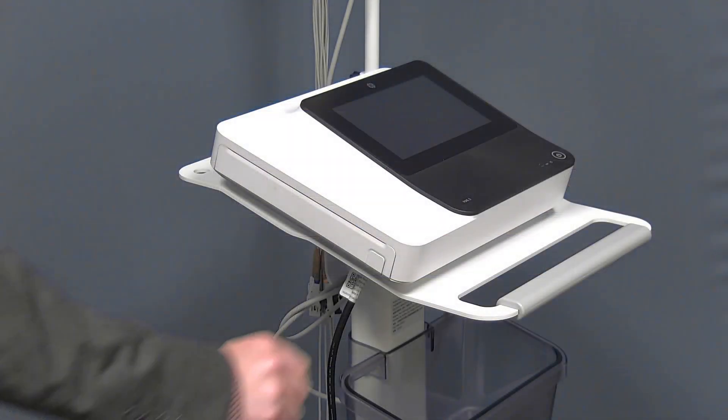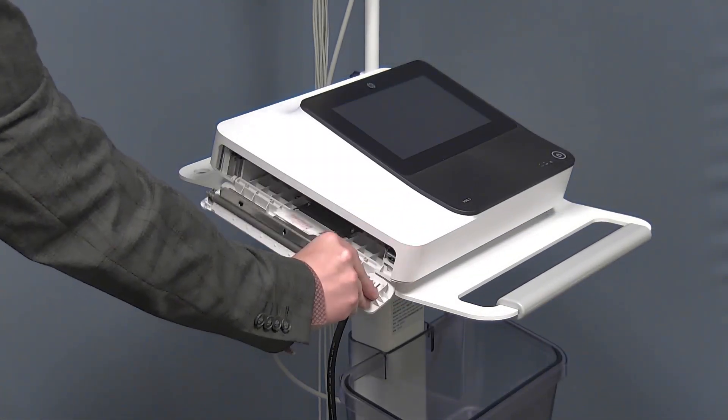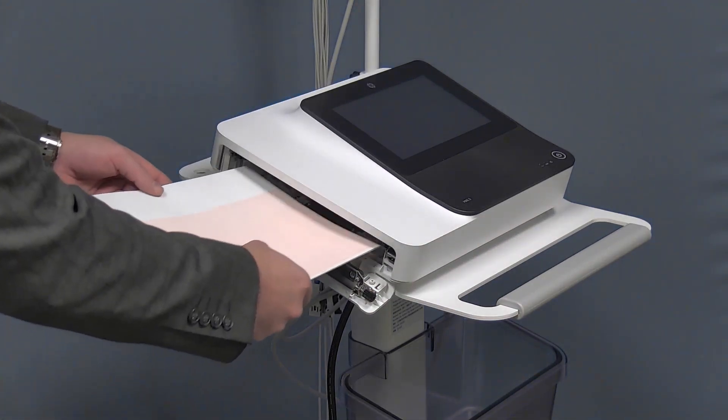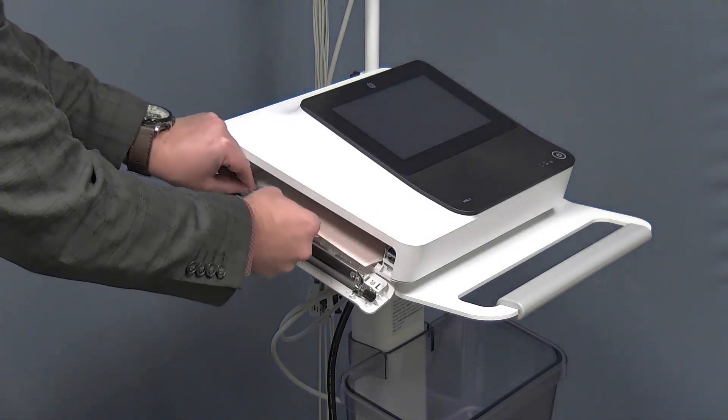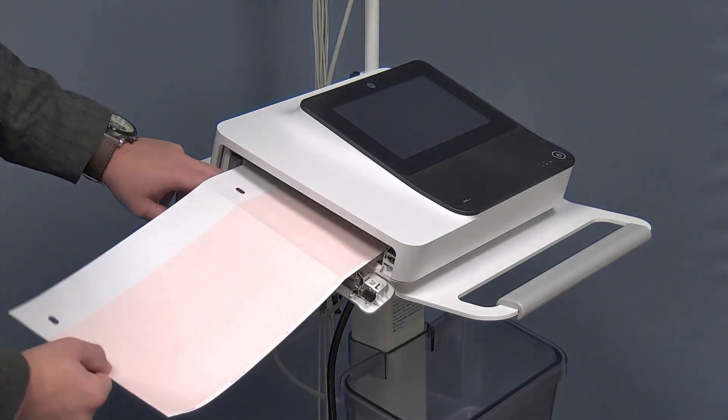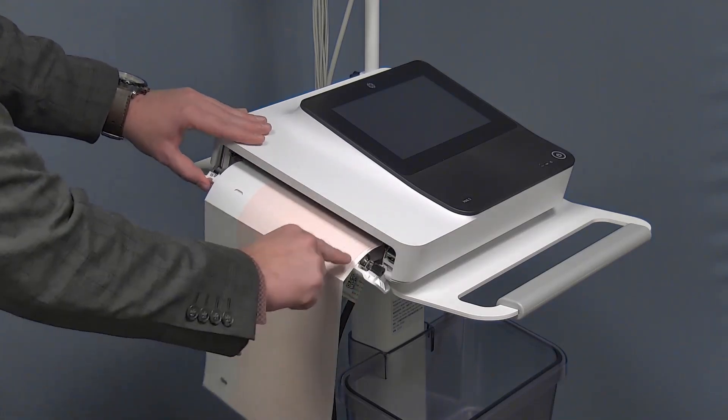To load the printing paper in the MAC-5, press the printer door button. Slide in the new pad of paper with the hole facing the top left corner into the paper drawer. Pull the top page of the ream over the roller bar, aligning between the two sides of the door, and then close tightly.